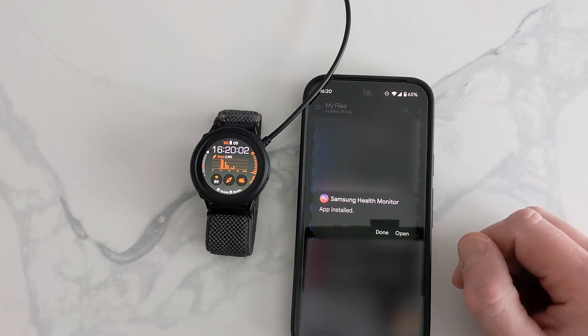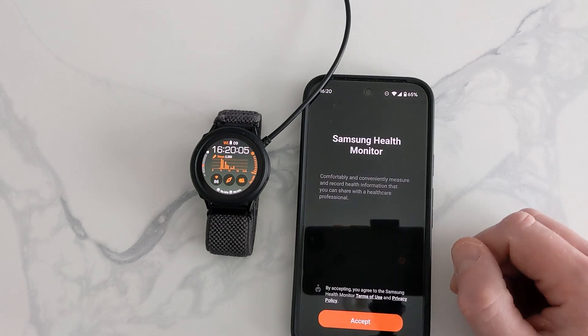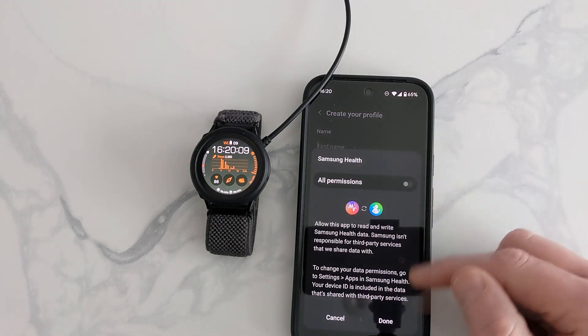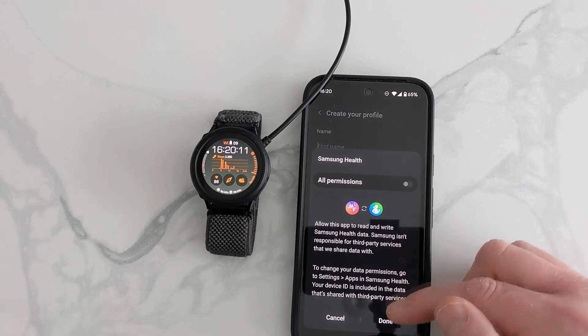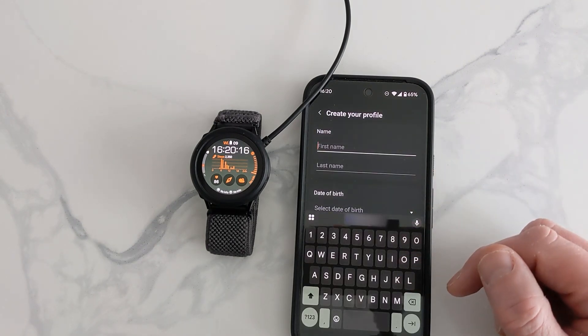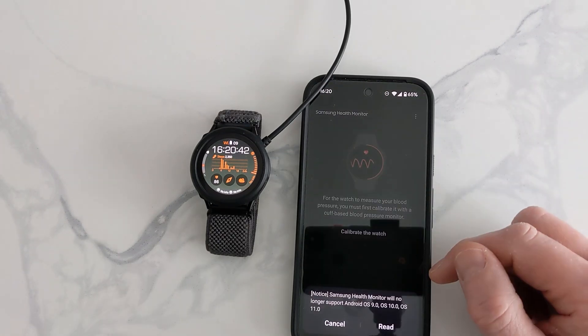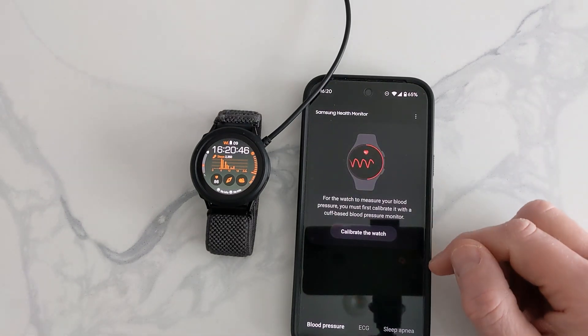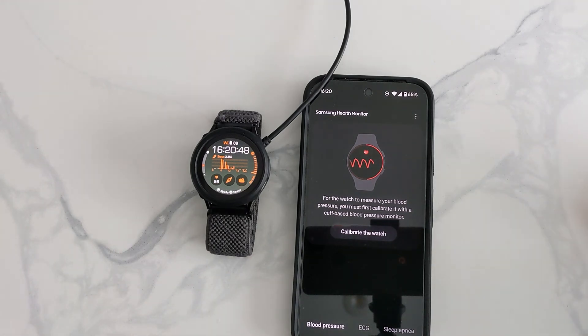Let it install, then open it and accept. This is where you would have to put a profile in, just like doing a stock install, so fill all that in. Once you're done with that step, you're ready to calibrate — I'm not going to show you that in this video, as my previous video shows you how to do it.